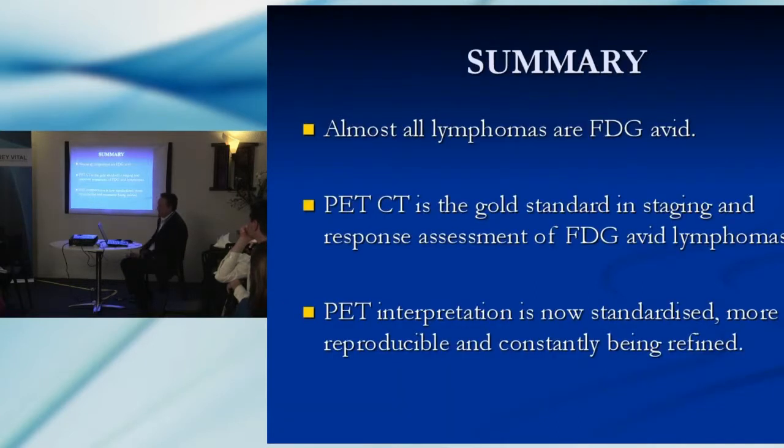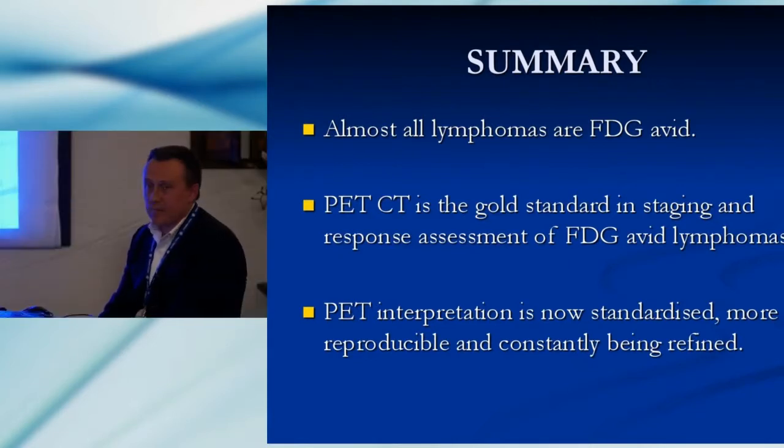So to summarise, almost all lymphomas are to some degree FDG-avid, and now PET-CT is recognised as the gold standard in staging and also response assessment for the FDG-avid lymphomas. And PET interpretation is now standardised. We're becoming more reproducible in the way we report it, and we are constantly refining the technique. And that's the end.